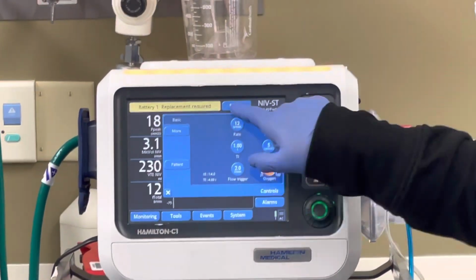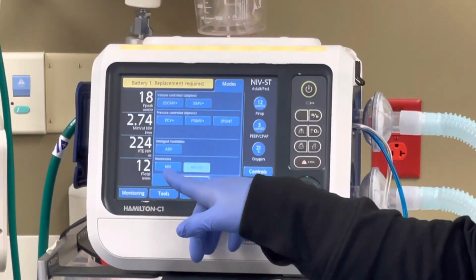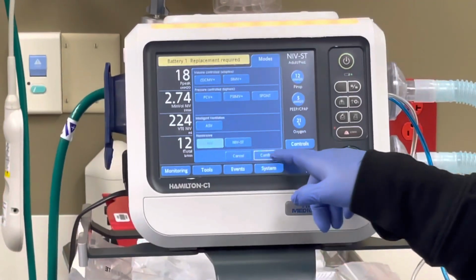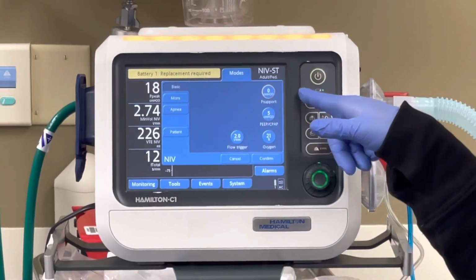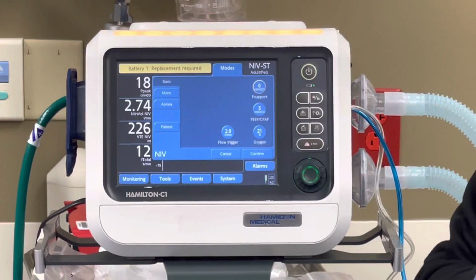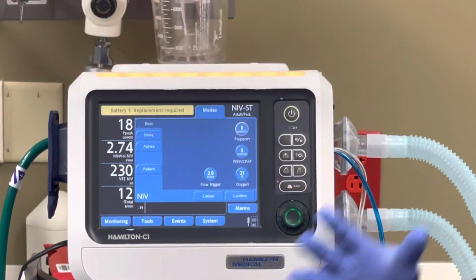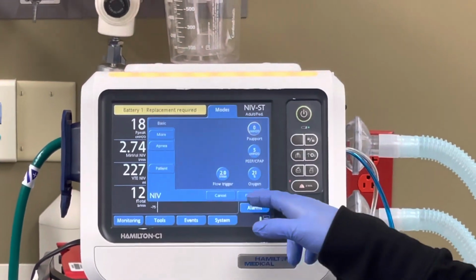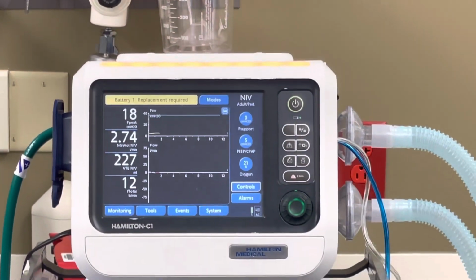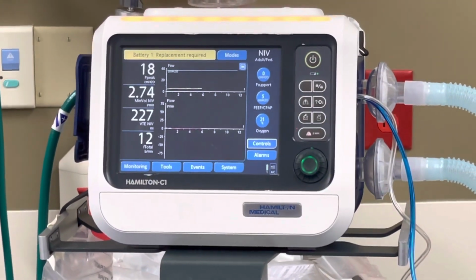So what I would do is go over here to modes and go to NIV. And on this one, you should be able to turn this off. You'll have to turn your pressure support all the way off, and then it'll allow you to do just a CPAP of 5, 8, 10, whatever the patient needs. And then you just confirm. Same mask, same mask. Okay.